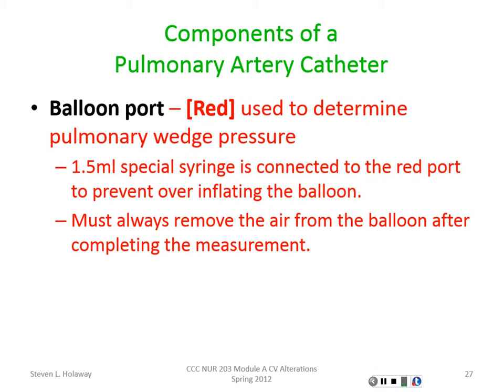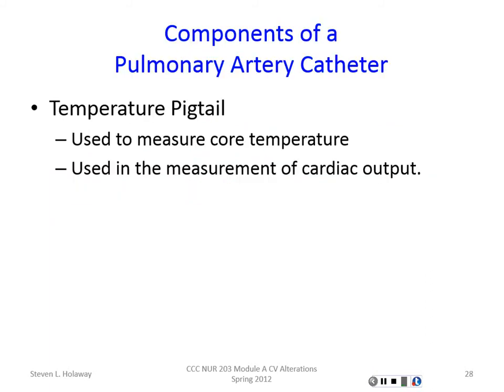Again, we're not looking at a single reading. We're trending those readings. Are we seeing that wedge pressure going up, which may indicate that this patient's going into left heart failure? Or have we been in left heart failure and we're seeing these pressures trending down, so things are getting better? That's what we're looking at with that wedge pressure per se. Again, I'm not trying to make you critical care nurses right off, but I want you to understand when you go into CVICU or go into someplace, you understand what they're doing with that.